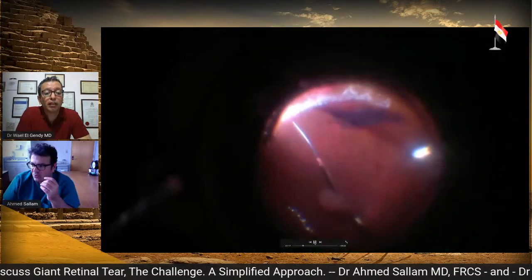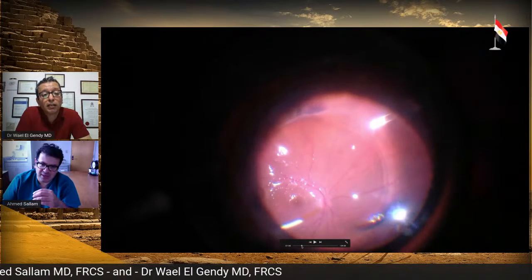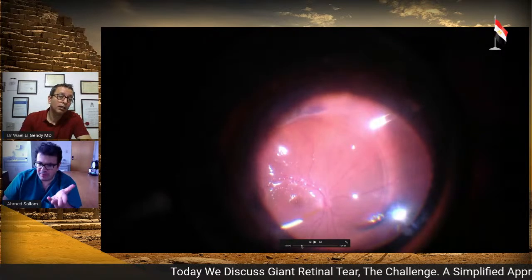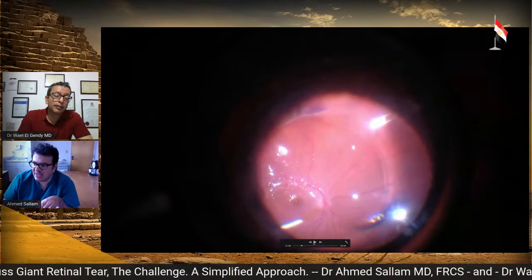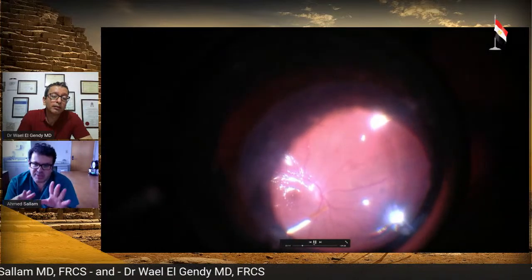And if you don't have a dual bore cannula, then I would use a 25 gauge with a 23 gauge setting, and that will actually lead to some leak. Okay. Because otherwise the pressure will go high. But this is a dual bore cannula, and the retina is not so detached, so you just inject and get the flap to unroll, and then it pushes the hemorrhage as well.